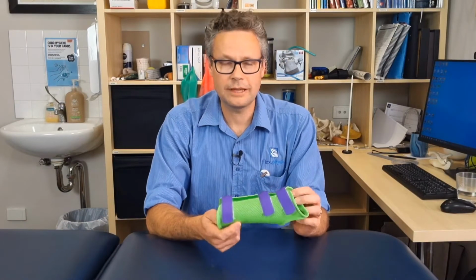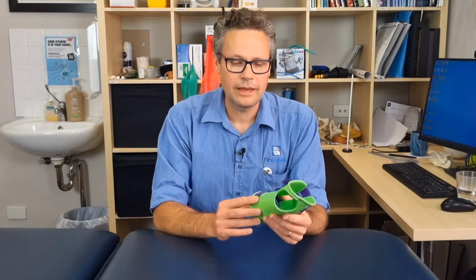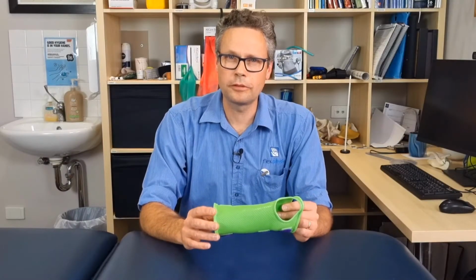It also means you can take them swimming, showering, you can even wash dishes with them on. And they're also very low profile, which means that there's more clothes you can get over the top of them, and they can even be taped onto the hand in some situations and for some sports to enable you to get back to sport faster and safer. Let's chat about what might go wrong with a thermoplastic splint.